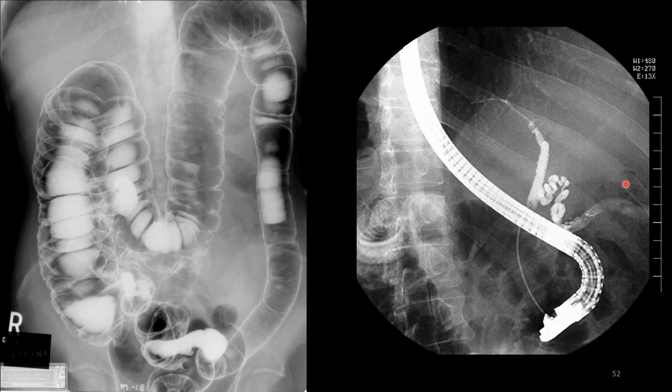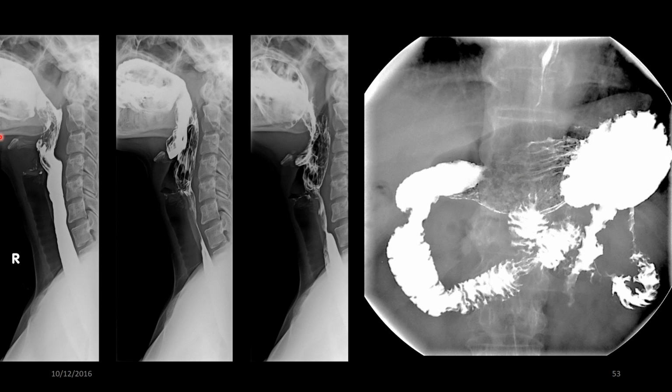And then we're going to move on, and I'll show you some barium swallows. So this, you can see there that the patient has got a bolus of barium in their mouth, ready to swallow. And then the consultant, or one of us, will say, can you swallow that down? And then we'll acquire some images as they swallow down, so we can see how well they are functioning. So I've just separated some out here. You can look on YouTube, and there are various videos of this where you can actually watch it in real time as it happens.